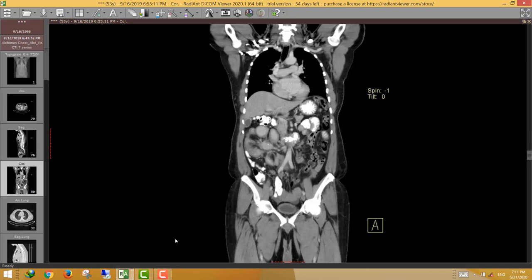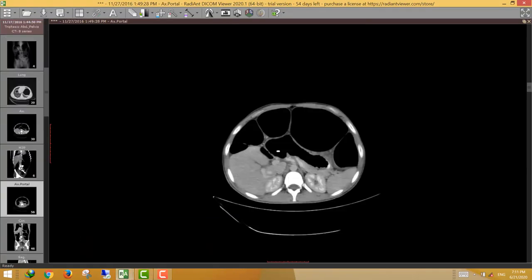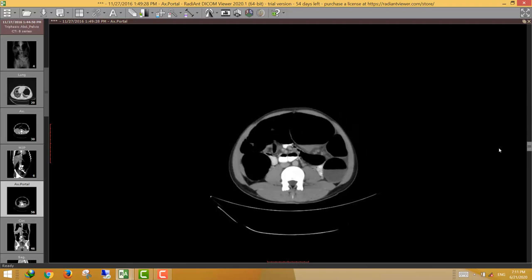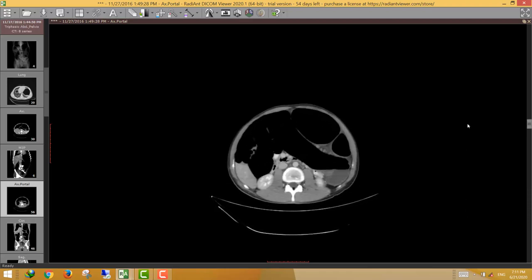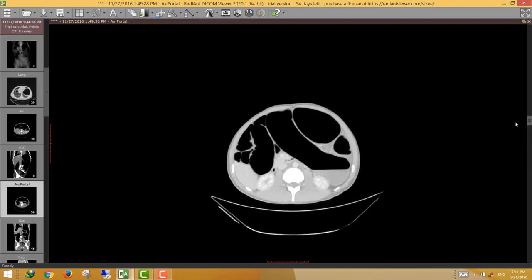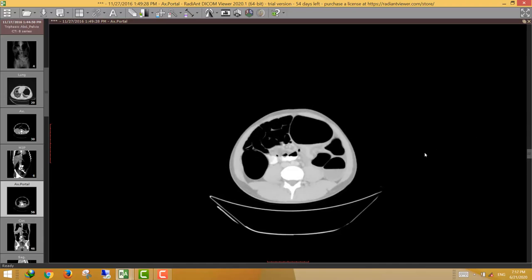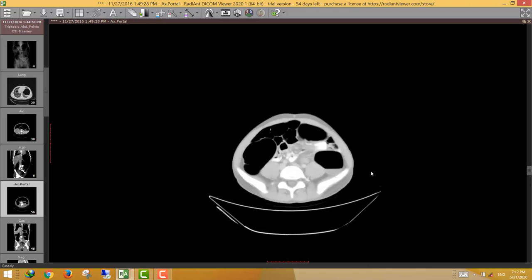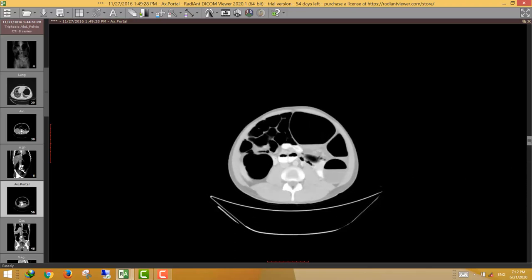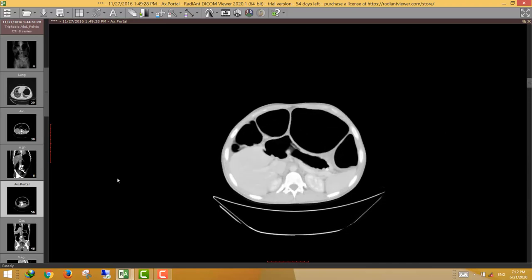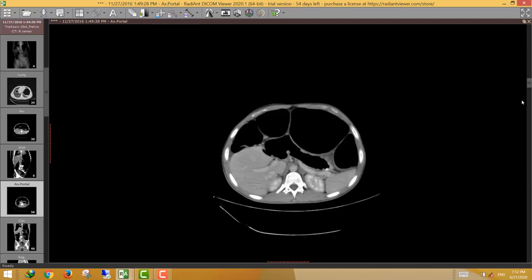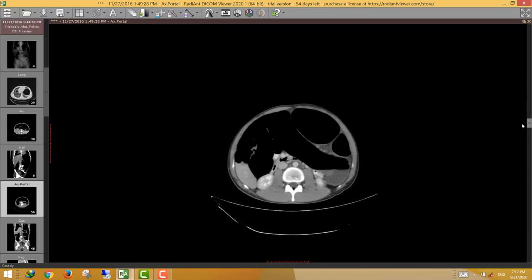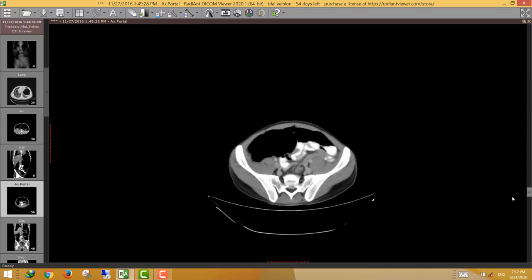This case is a little difficult. The patient came with signs and symptoms of bowel obstruction. We can see marked bowel dilatation with multiple air-fluid levels — radiological signs of bowel obstruction.